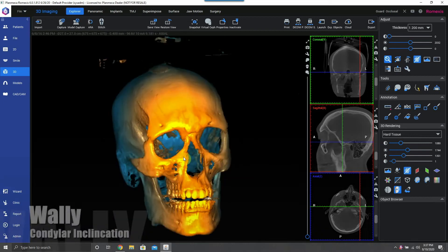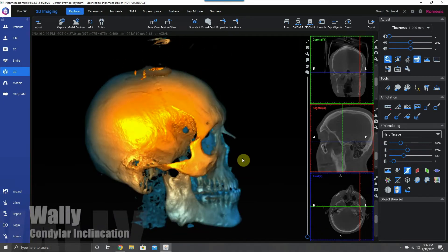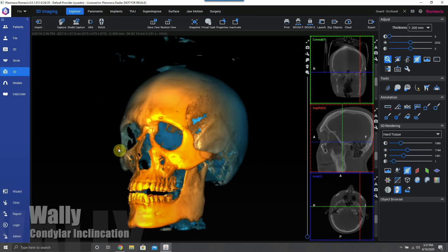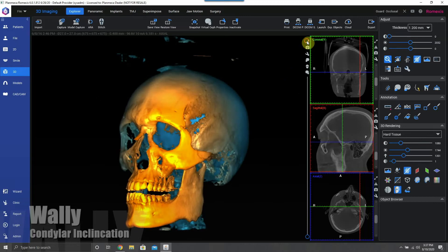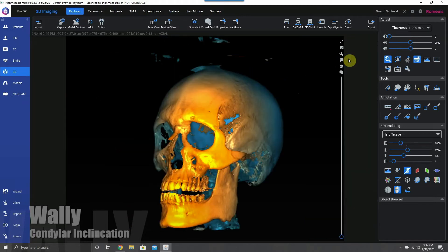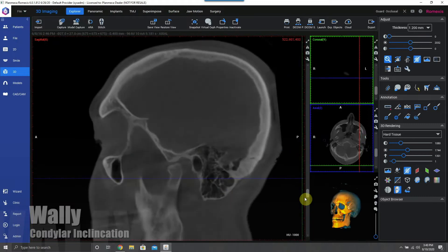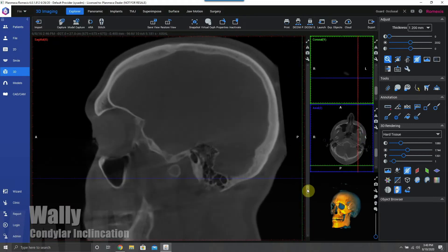Hey guys, Wally Rene here, and I'm going to be showing you how to measure condylar inclination on your skull scans for the purposes of entering into virtual articulator software.